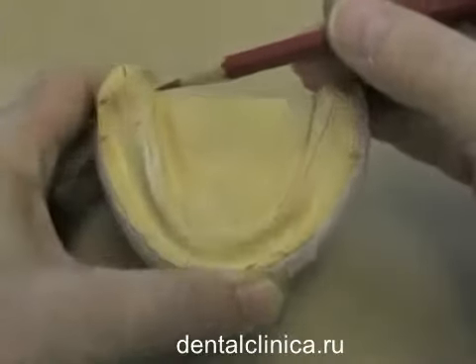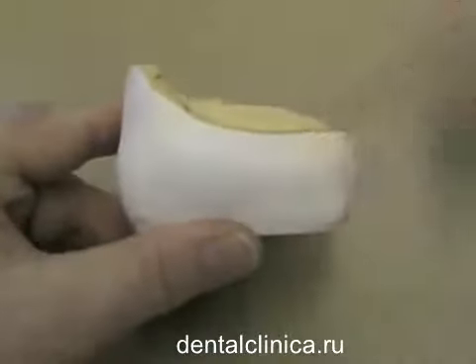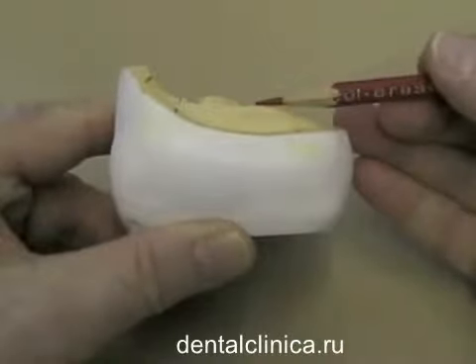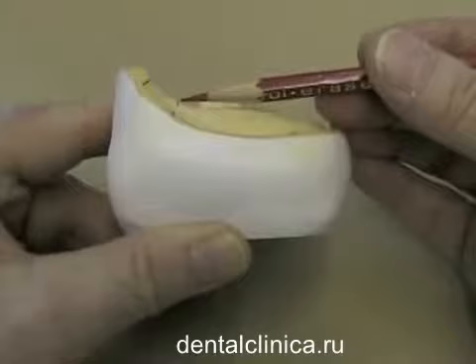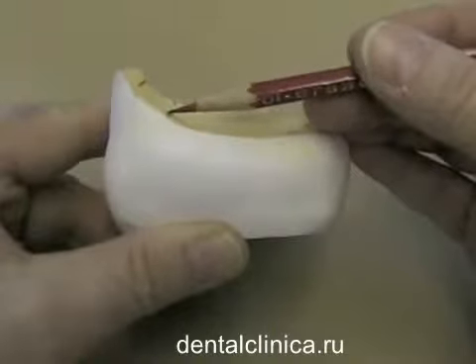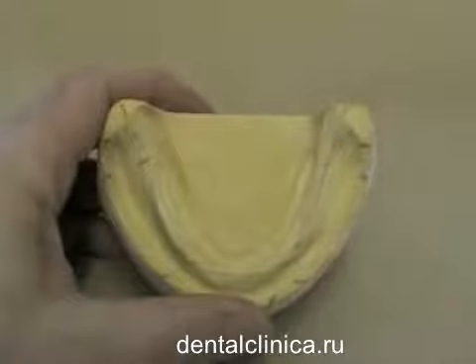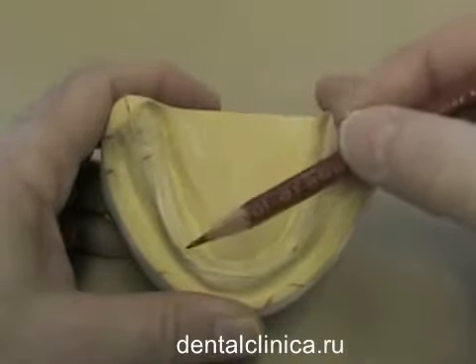In addition to the retromolar pad, you should take a look at your arch from the side and take a look at where the horizontal plane of the residual ridge is, and then determine where that horizontal plane starts to become more vertical, and put a line there on the ridge and bring that out onto the land area as well. And a very important reference line is the midline of the mandibular ridge.